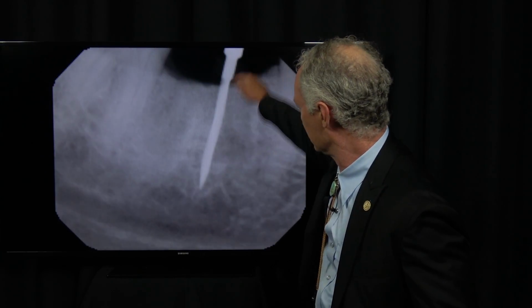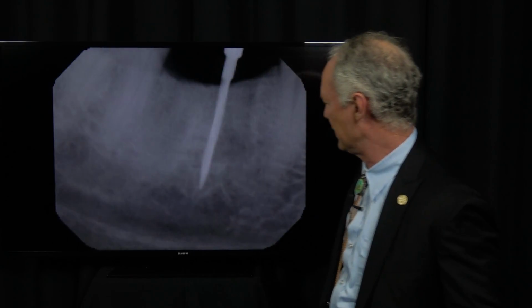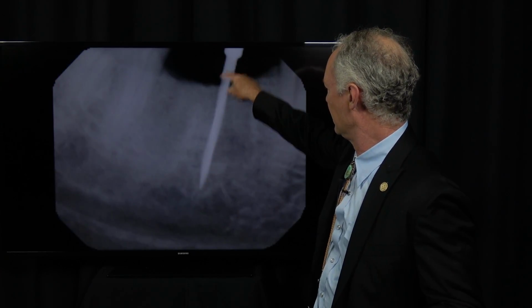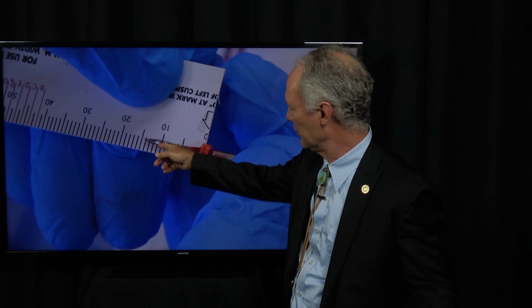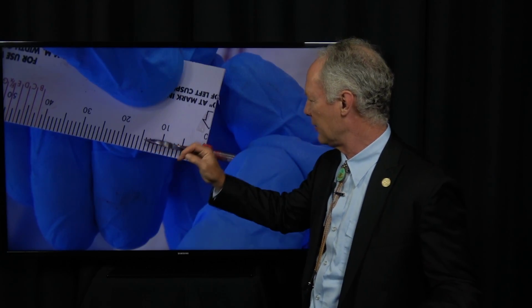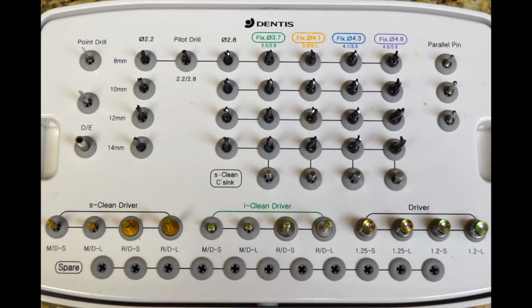There's the mental foramen. You can see I'm in good shape right here at that depth. So I'll probably go to about this depth. And I'll measure from here to the rubber stops on my pilot drill. And in this case, I know that I'm perfectly good at 12 millimeters. That was 14 millimeters from alveolar crest to the tip of the pilot drill. So I'm going to go back 2 millimeters and use a 12 millimeter drill.